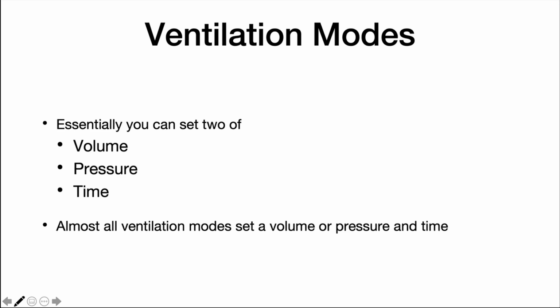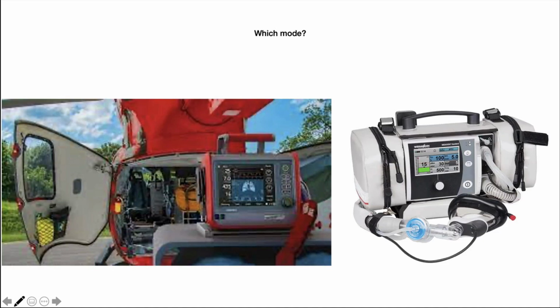The selection of using volume controlled or pressure controlled ventilation is based on whether consistency of tidal volume delivery is important or limiting of pressure delivery is important. It should be noted that the modes available also depend on the ventilator used in your service. The Hamilton T1 utilises a number of ICU modes of ventilation, while the Meduvent recently purchased by St John has only IPPV and CPAP as standard.